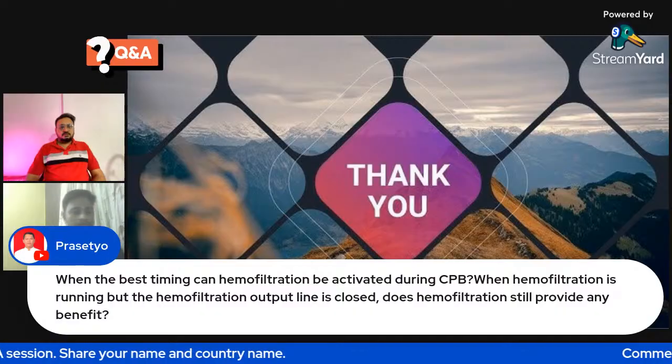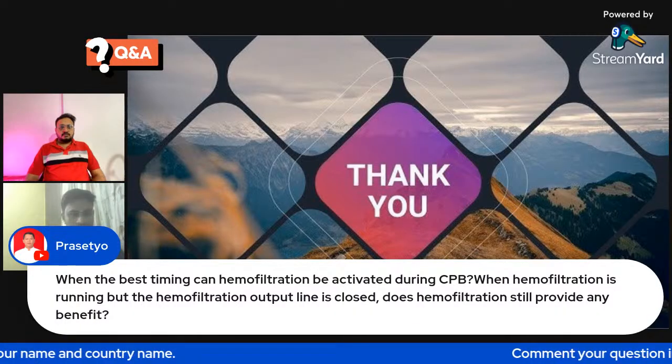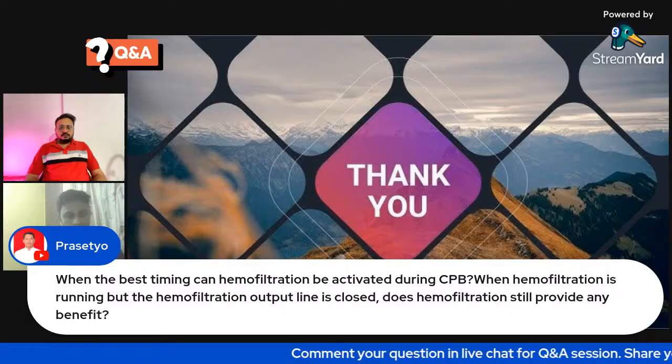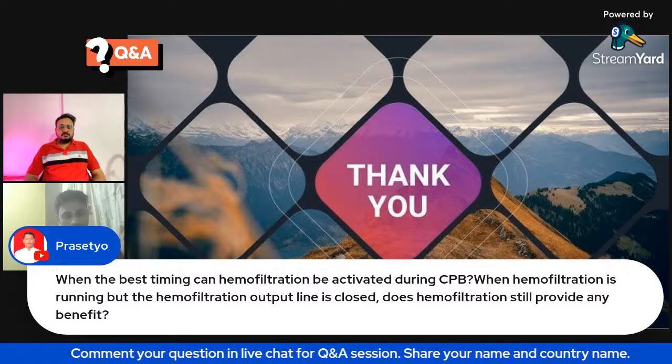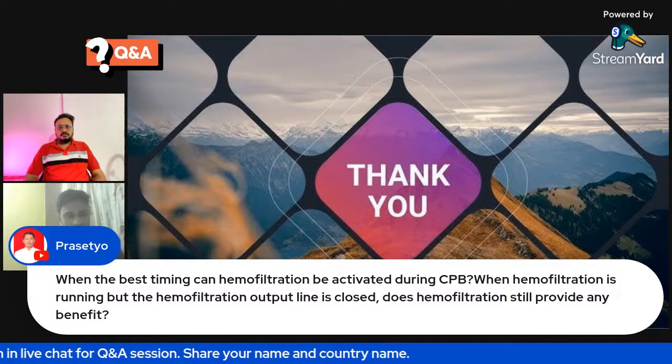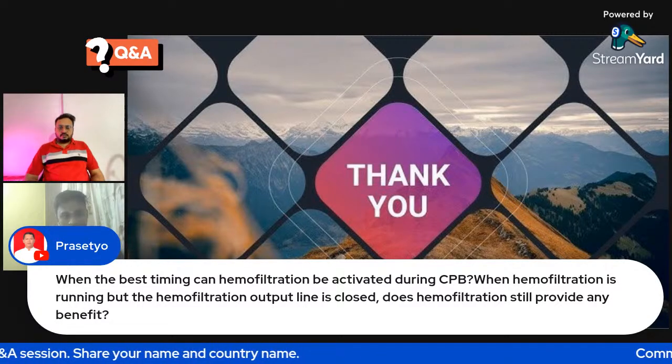And one more thing, if the patient's hematocrit is low, it is also useful for removing fluid. And rewarming time ZBUF is useful. Most inflammatory mediators are released in the rewarming period only.